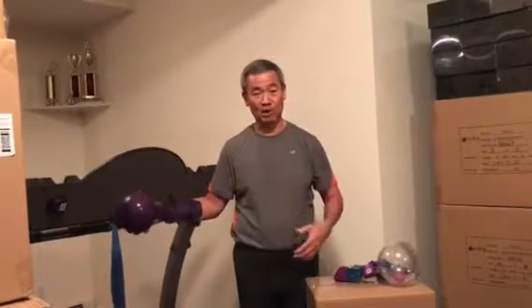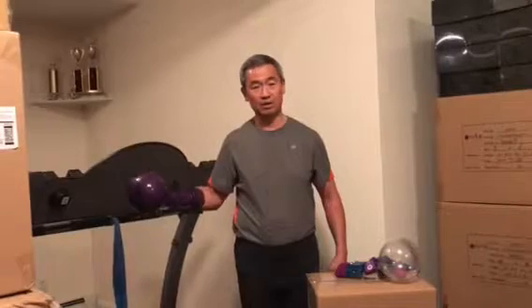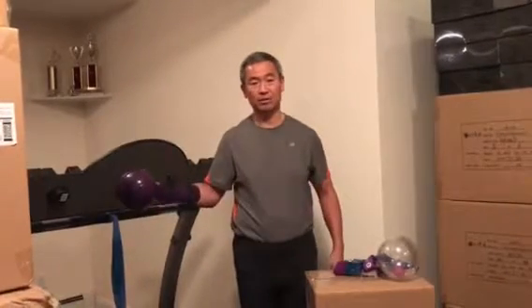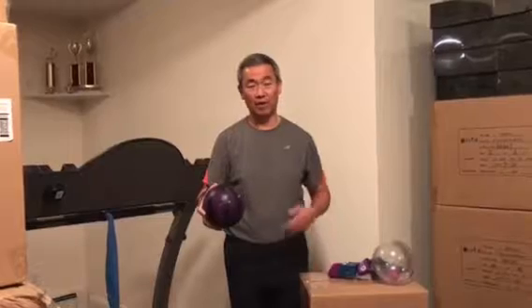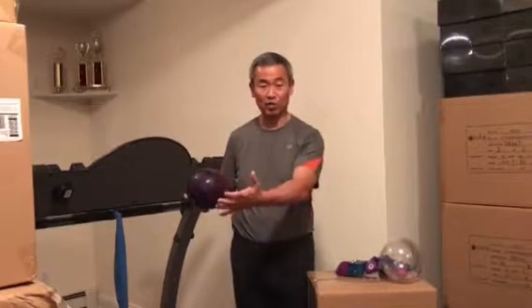So for the internal rotation, you start from here, 1, 2, come to the midline, 3, 4, and so forth. And then, of course, you can do the front and back. Again, there's no need for a rubber band to tie down to anything.